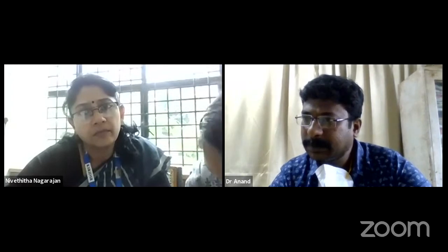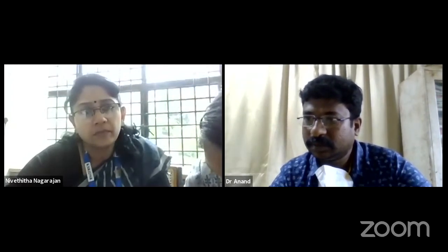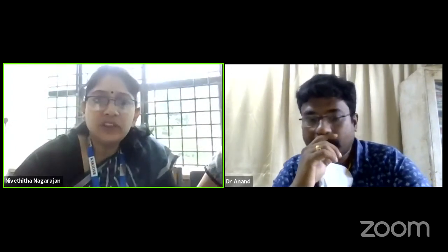Because most of the machines currently available have a fixed FOV. Ultimately you are going to use a particular segment of the image for your diagnosis, but the patient is exposed throughout. I mean, the entire patient's head is exposed. Yes, sir. But in smaller FOV machines, only that particular area is exposed. Can you alter the FOV so that the patient can get less exposure? Certainly, we can do that, sir. But it is not available in all. As I told you, we have different ranges of machines in the market. Only in specific machines are those options present. Right. Thank you, Anand. You can resume with your presentation.